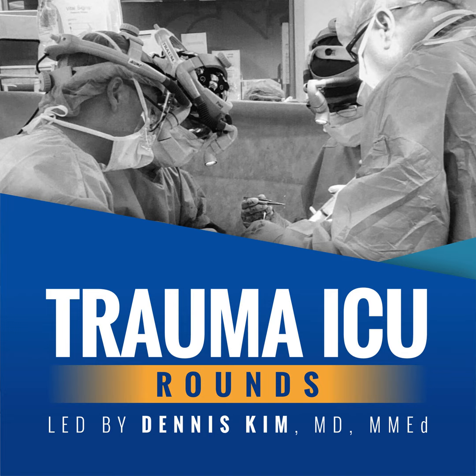Now, as patients improve, one could envision decreasing the respiratory rate or the number of mandatory breaths that patients are receiving on SIMV, and perhaps also coming down on the amount of pressure support for the assisted breaths to the point where patients are performing the work of breathing on their own and they are now ready for extubation or liberation from the ventilator. Regarding spontaneous modes of respiration, there are really three.